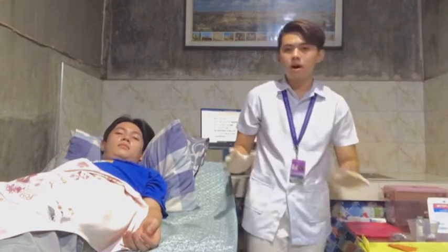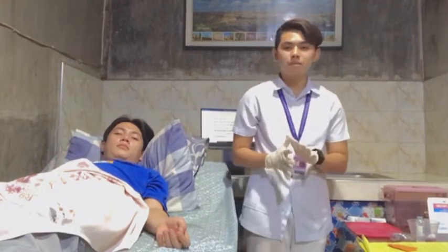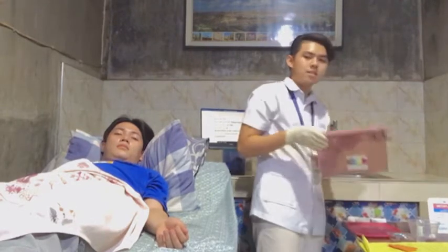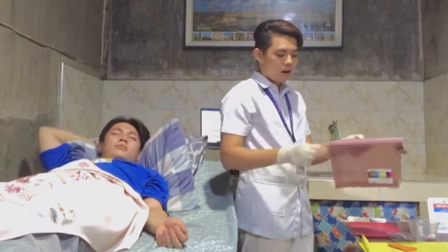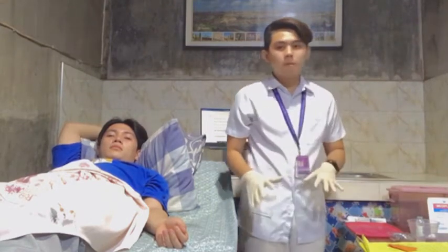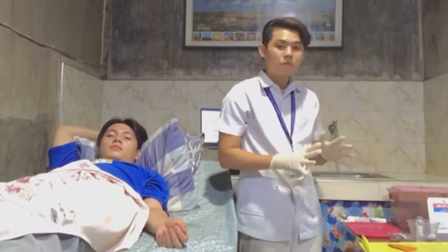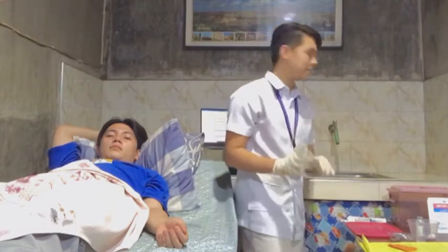Okay, so take note to avoid recapping the used needle and discard it with the syringe in the appropriate receptacle to prevent any needle prick injury. As you can see a while ago, this is my waste receptacle. As I withdrew the needle, I immediately wasted it in the receptacle. So that is the right procedure to do. So lastly, we need to wash our hands to deter the spread of microorganisms, of course, before documenting the procedure, and interpret the results after 30 minutes.